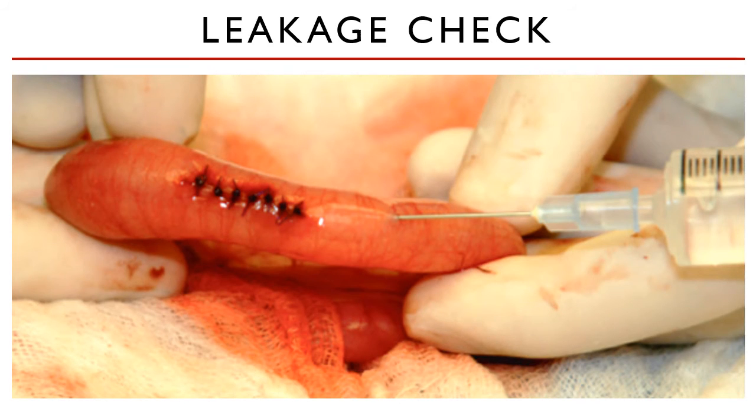Leakage check is an important step after any intestinal closure. This ensures that your sutures will hold and no ingesta will spill once the abdomen is closed, and food and fluids will go through that segment again. With the intestine still occluded, as seen in this image right here, get a 3 ml syringe with warm sterile saline capped with a 25 gauge needle. You could use the orange one, and insert this through the intestinal wall.